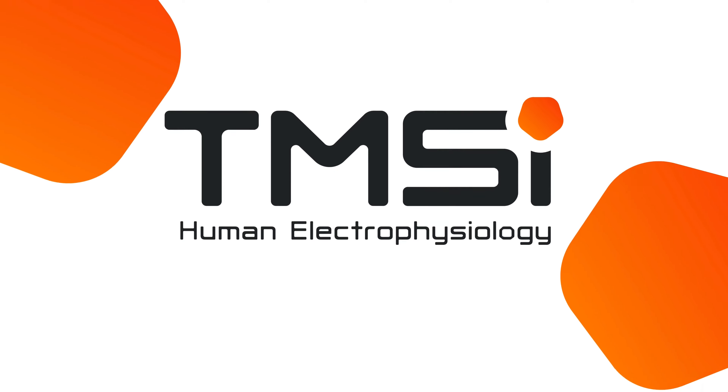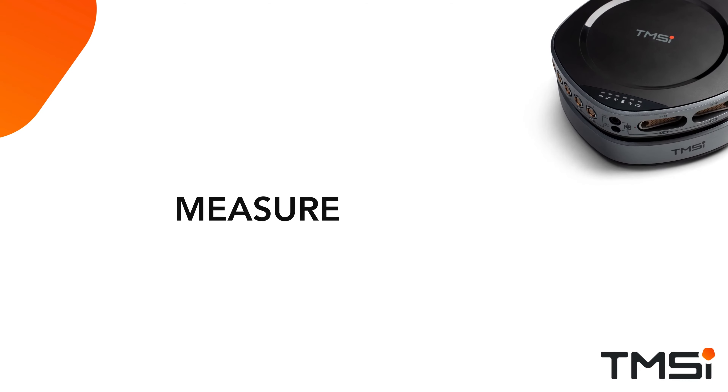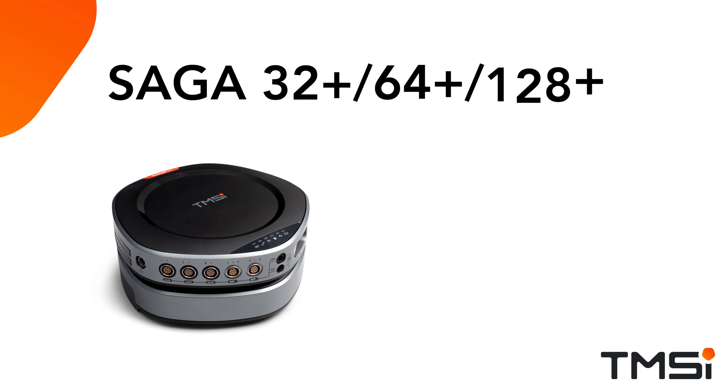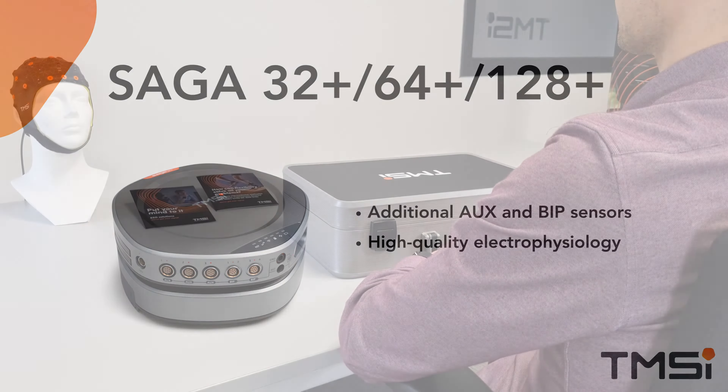Welcome to the unboxing of the Saga device for EEG and HD-EMG measurements. Saga is an EEG and HD-EMG amplifier designed to measure human brain and muscle activity. In its 32 and 64 variants with multiple AUX and BIP sensor options available, you can easily measure high-quality human electrophysiology for your research.